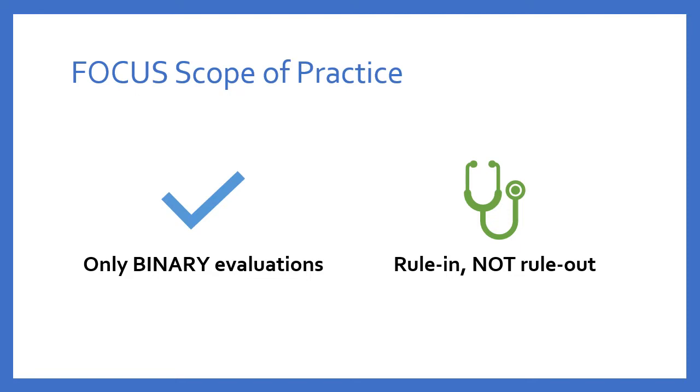And lastly, we should feel comfortable saying, I don't know. If the image is just not good enough, or if we are not able to see what we want to see, then we need to find other ways to answer our clinical questions.